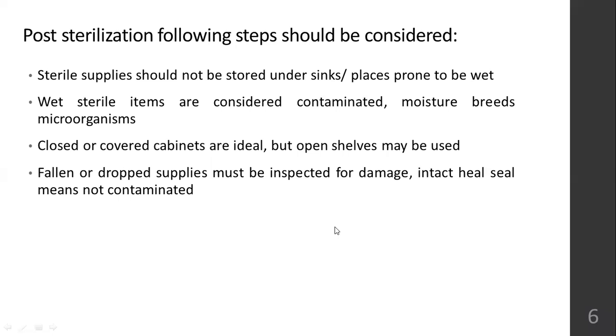Closed or covered cabinets are ideal. Don't keep it on an open shelf. Open shelves can be used if you don't have any other option, but ideally closed covered cabinets are the first option. Fallen or dropped supplies must be inspected. If anything falls off or falls down, it has to be inspected.